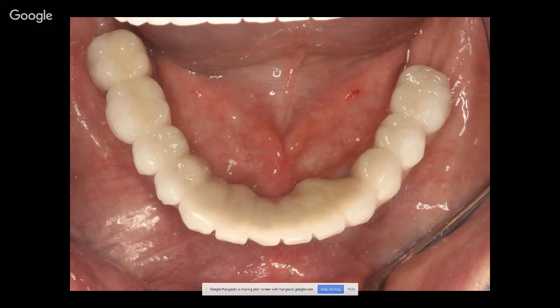How do you treat the dental papilla? Do you cut only the vestibular or also the lingual? I'm guessing you mean this case because we only have papilla in this case. I do not remove papilla. Some people would just remove the papilla. I'm fine with that if you want to do that, but I try to keep as much soft tissue as possible. So I make an incision in between each tooth, incising the papilla through, reflecting back.